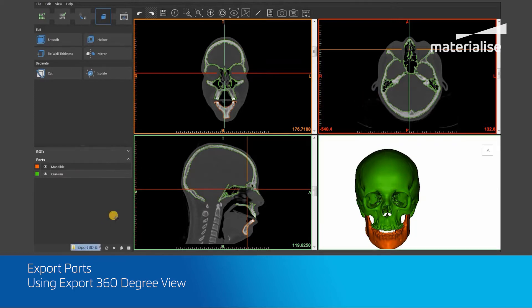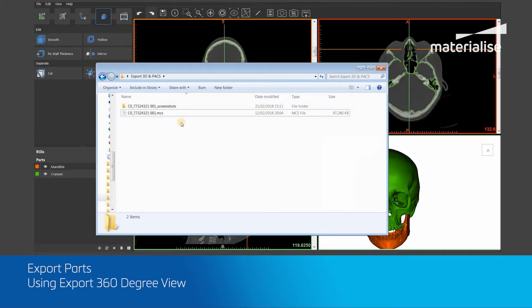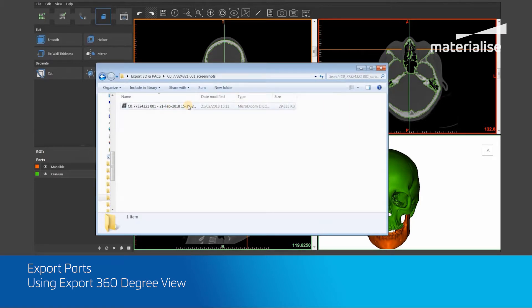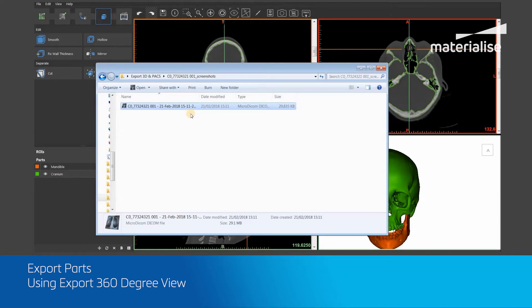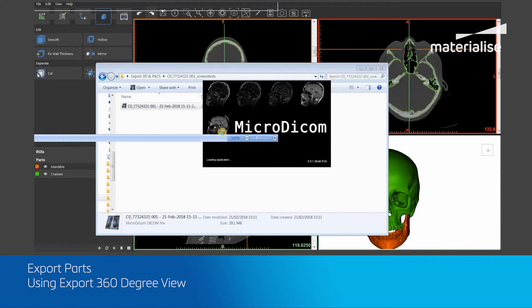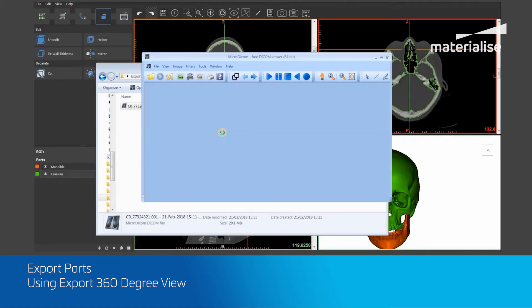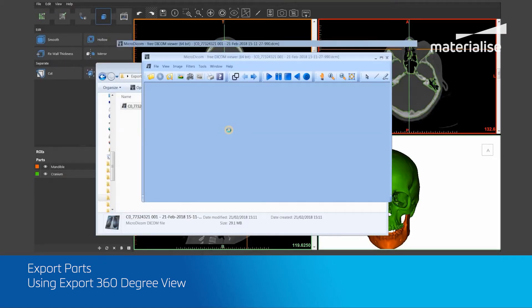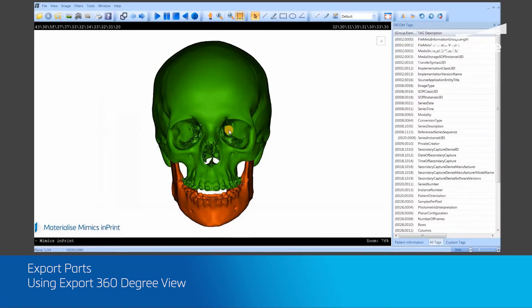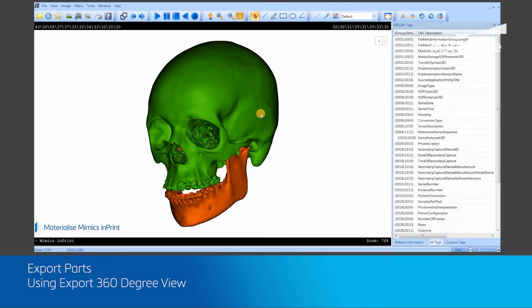If you open this DICOM file within a DICOM viewer and scroll through the images, you will see that the models rotate around a fixed vertical axis, hence providing a 3D visualization.